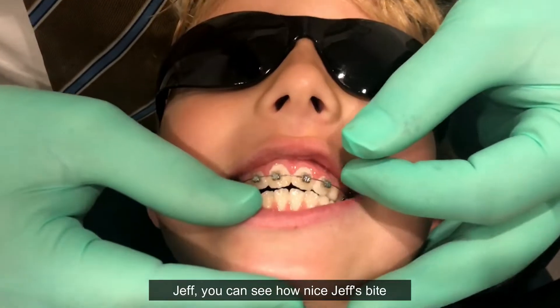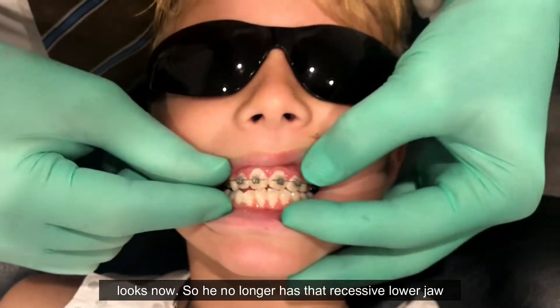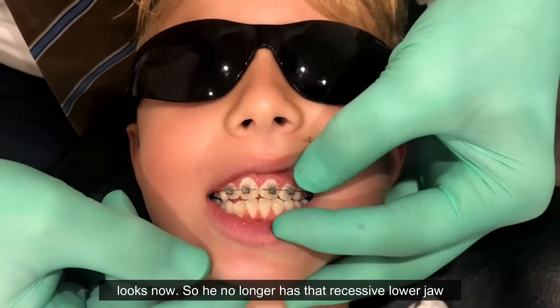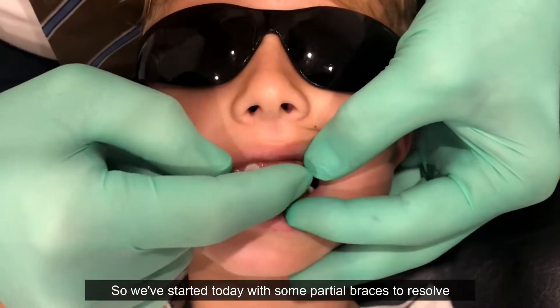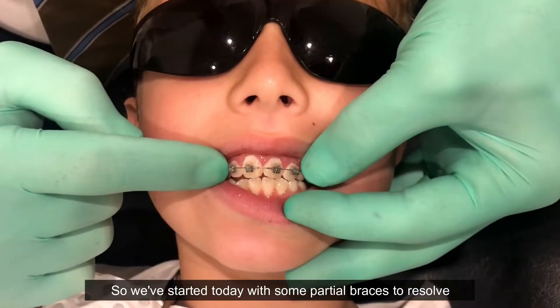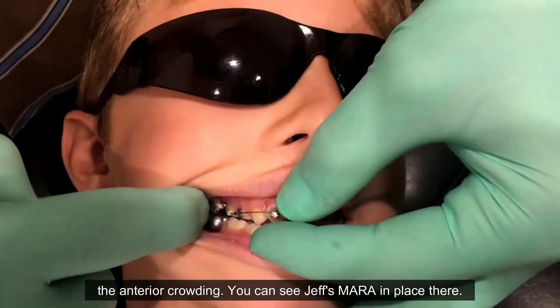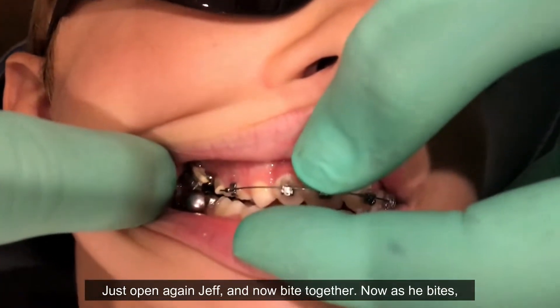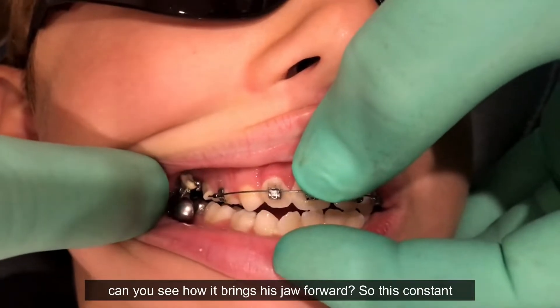Coming back to Jeff, we can see how nicely his bite looks now. He no longer has that recessive lower jaw and has good positioning of the upper and lower. We've started today with some partial braces to resolve the anterior crowding. You can see Jeff's MARA in place there. As he bites together, you can see how it brings his jaw forward.